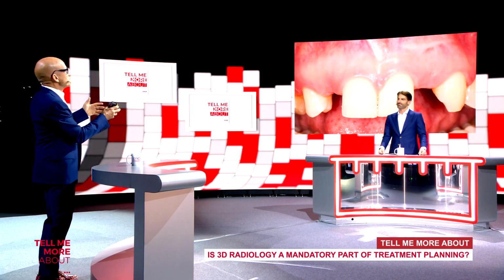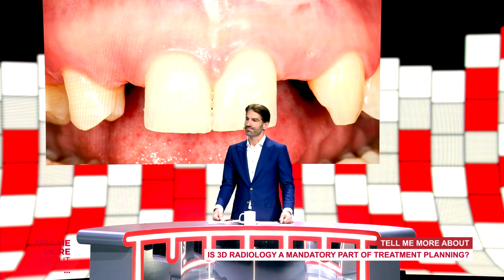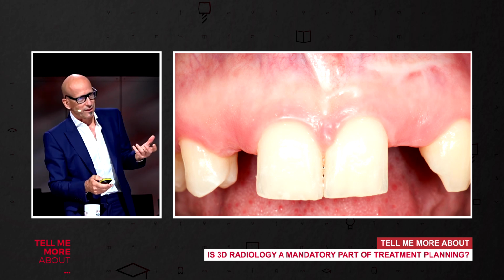And when you see the patient in your clinic only twice in comparison to 8 to 10 times, you are for sure more cost effective. And the morbidity of your treatment is decreasing. And the time is also decreasing. So you start now really to fulfill the requirements of your patient. And this is what I mean where we need this new technology.